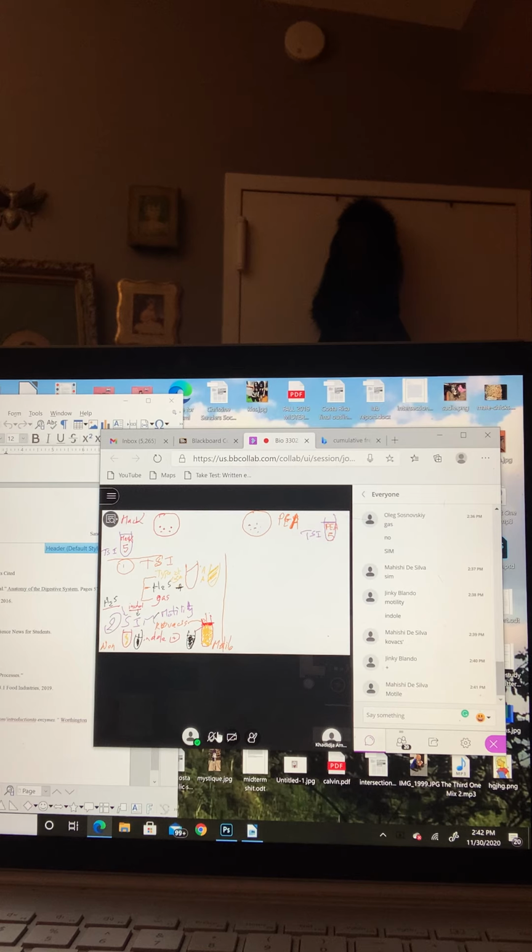We'll talk about the next test, the Simmons citrate test. The Simmons citrate test is a blue or green tube. It's green. Good. Citrate.